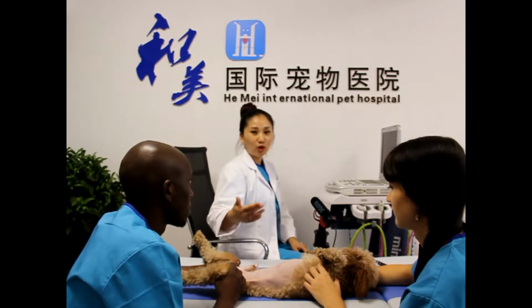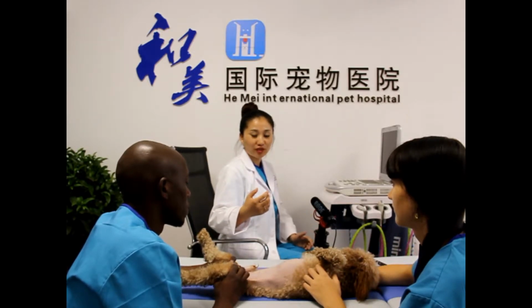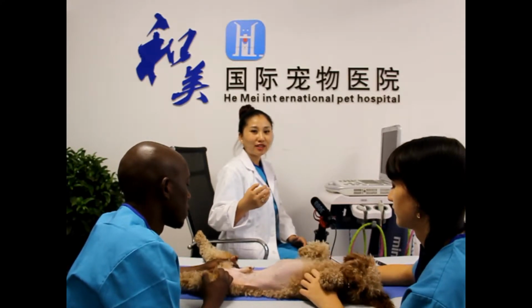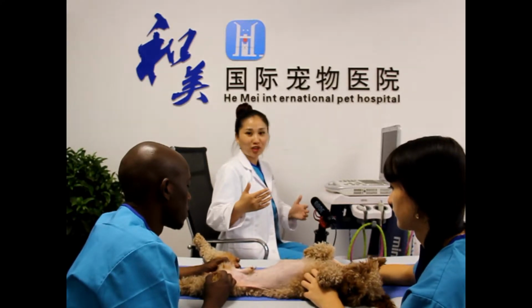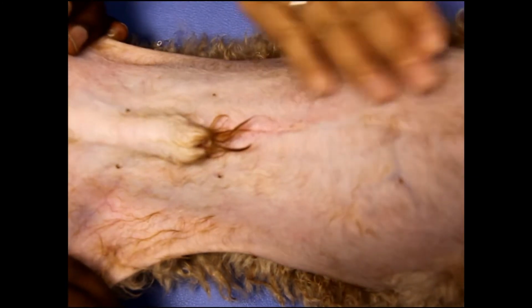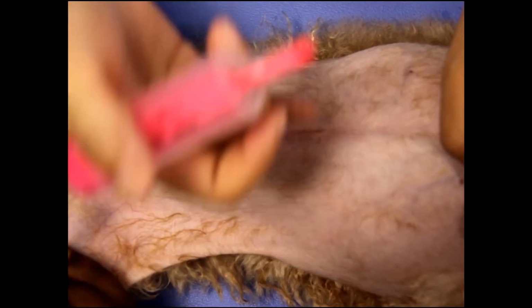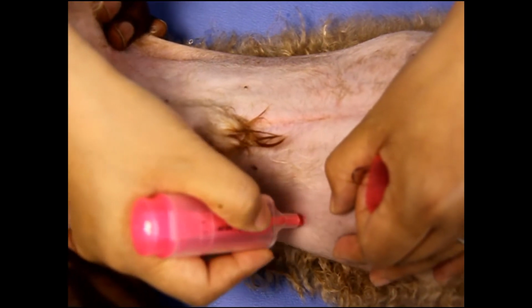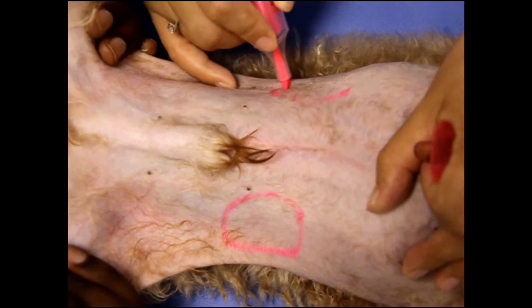First, I will talk about the anatomy, as we all know that anatomy is very important. If we know the anatomy and how to use the organs as landmarks to find the adrenal glands, it will save you a lot of energy. Now I will draw a picture to show you the landmarks. We will use both kidneys as landmarks to find the adrenal glands. So first, here is the left kidney. Here is the right kidney.